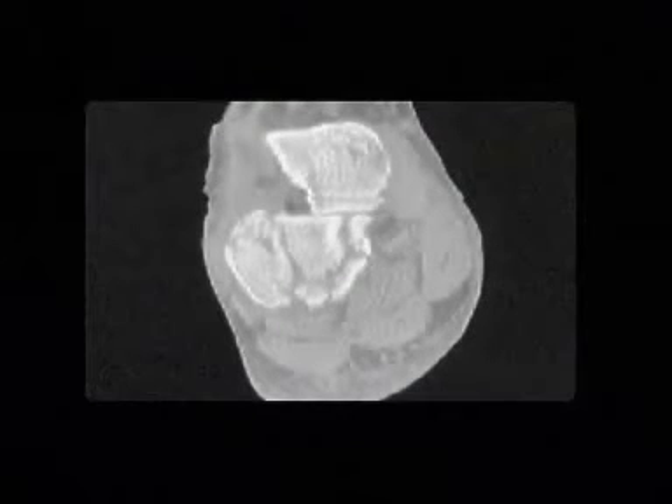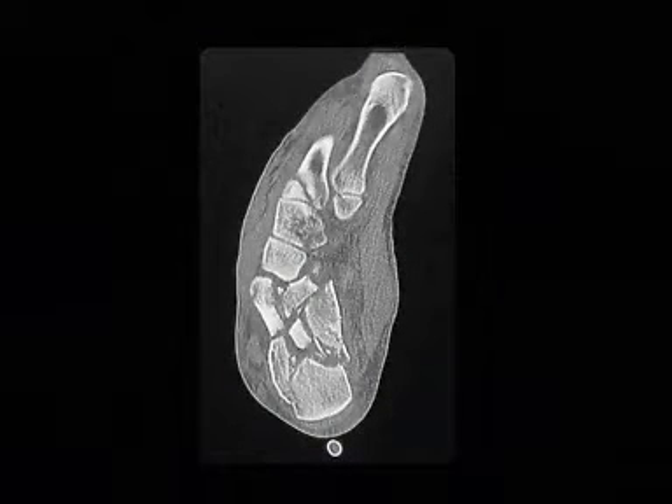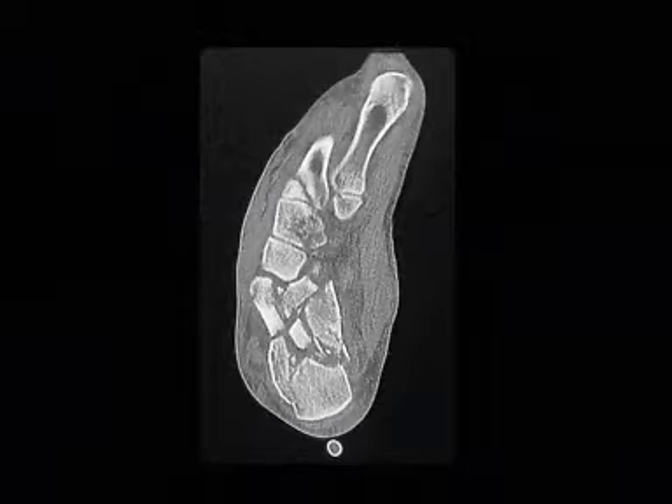The coronal CT scan shows the involvement of an intermediate fragment of the posterior facet, and there is an additional displaced fracture of the anterior facet. The axial view shows the severe destruction of the cuboidal facet of the calcaneus. Because three joints are involved, this fracture is classified as a B3 fracture.